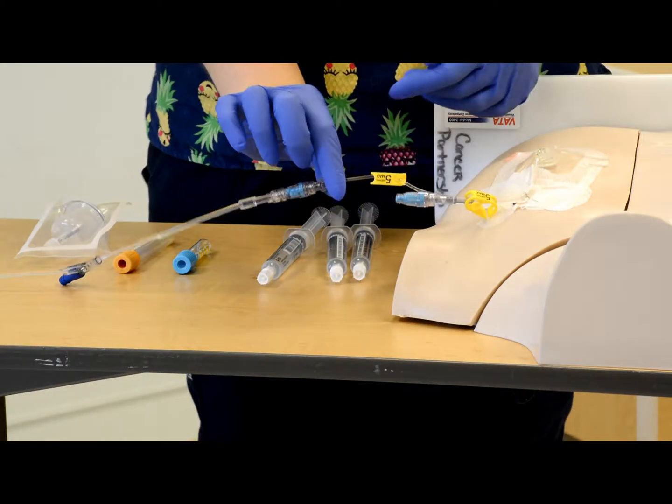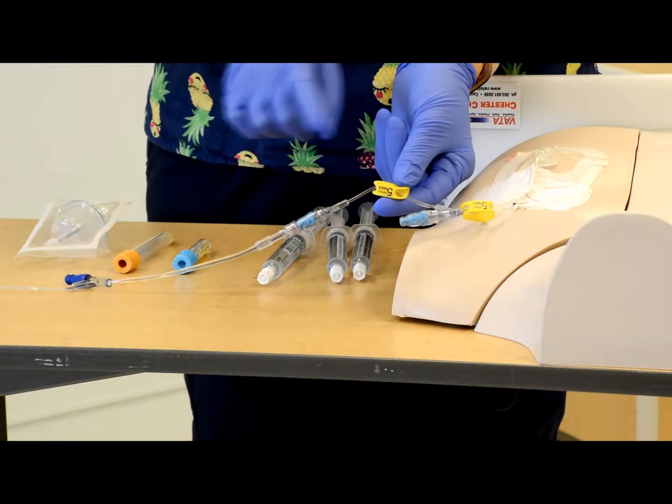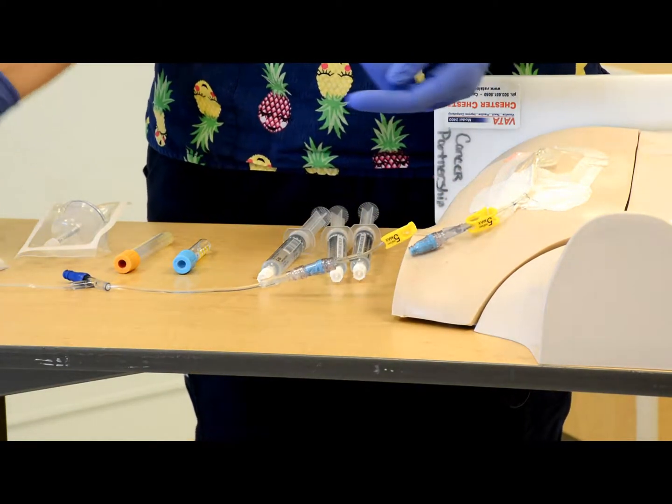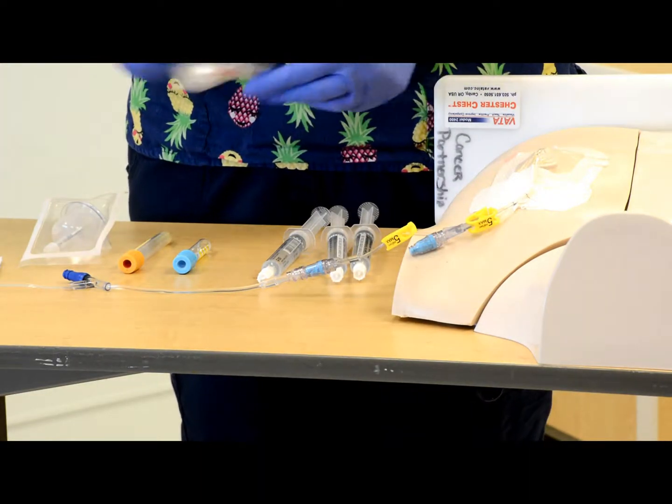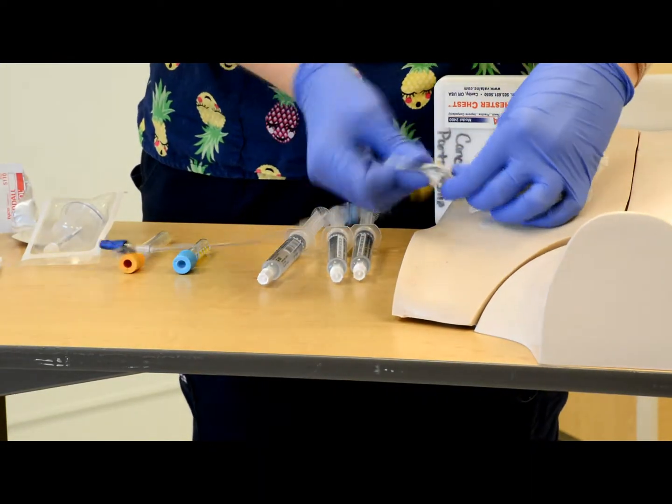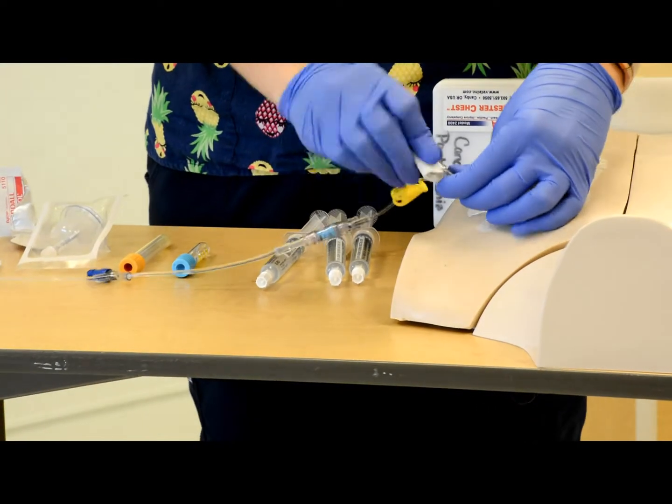Now make sure that you have your tubing clamped to your continuous infusion and your pump is stopped. Take your alcohol swab, and you're going to vigorously scrub the hub for 10 to 15 seconds.